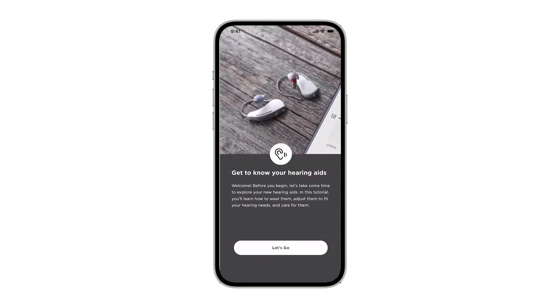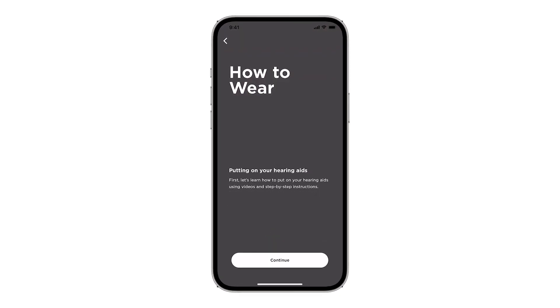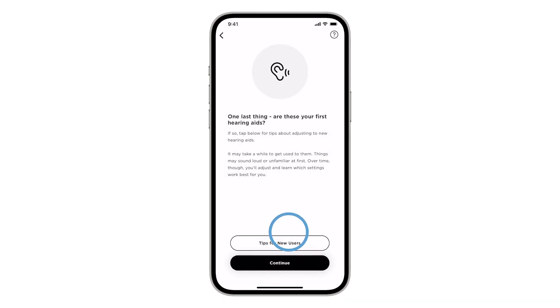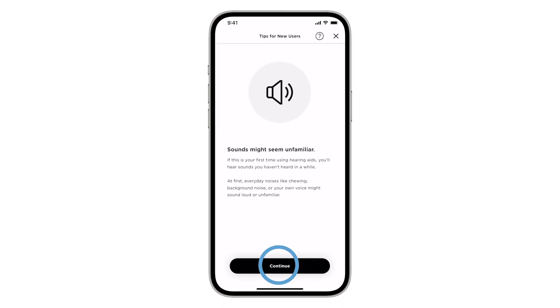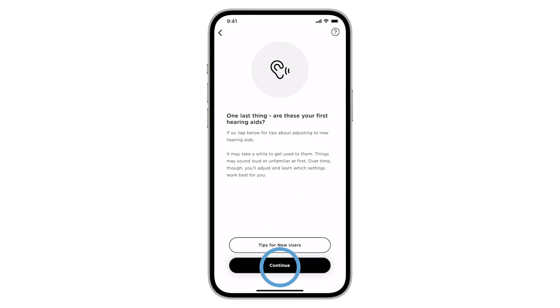Once the hearing aids are connected, the app will give you an overview of how to wear and maintain your hearing aids. There's also an interactive tutorial and tips for new users. Take the time to explore these menus to get the most out of your Bose SoundControl hearing aids.